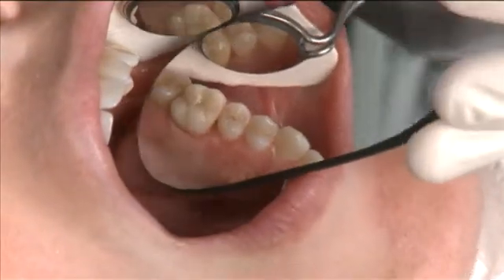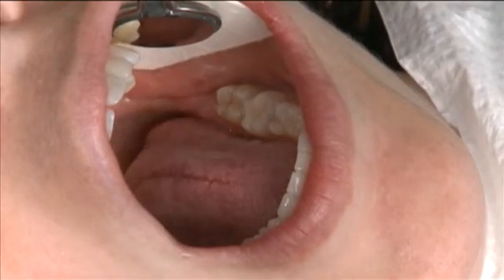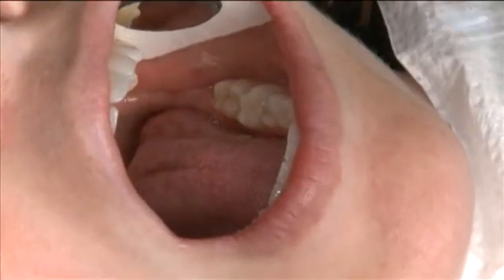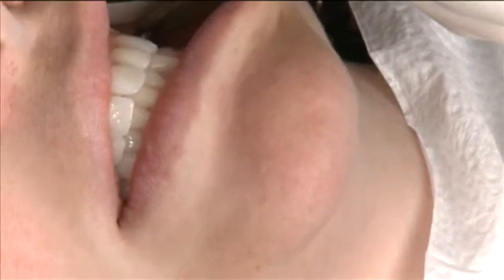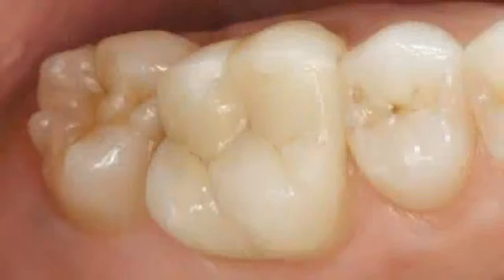Now that we've delivered the restoration, let's take a look at it. You can see we've got a highly aesthetic and conservative all-ceramic CAD-CAM onlay. I have not touched the occlusal surface at all in terms of adjustments, and Laura is holding shim stock very nicely on the contact distal to the tooth that's been restored. In this example, we saw a CAD-CAM onlay created via this new digital impressioning system with the CEREC AC Blue Cam, and the result was a restoration that fit perfectly — not only marginally, but also in terms of the occlusal fit. This restoration is going to last this patient for many years to come.